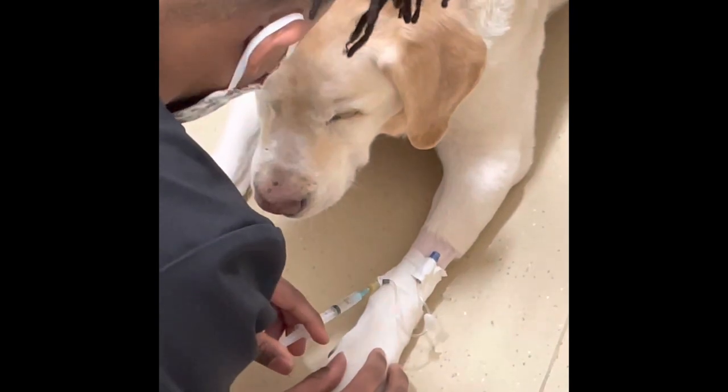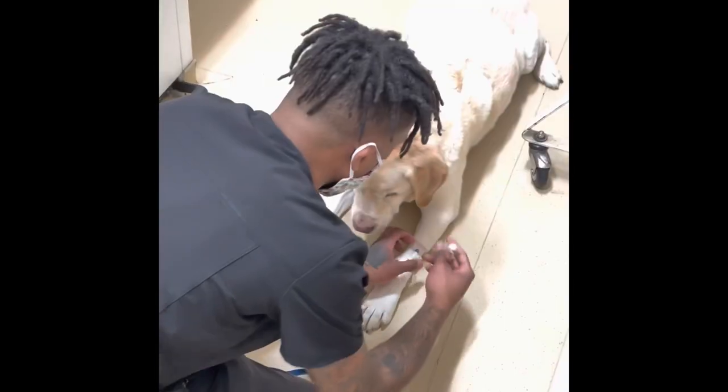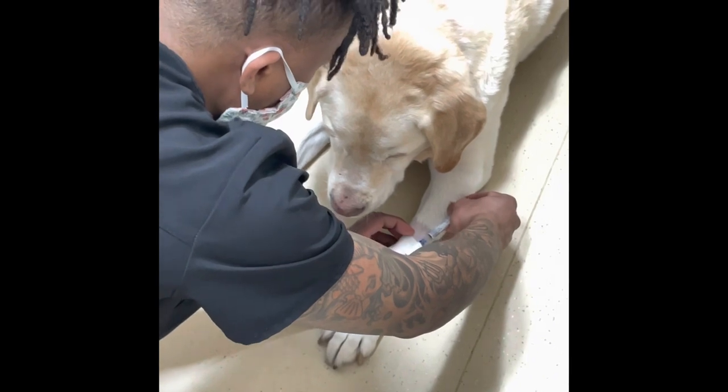First, I'll slowly inject the drugs into the IV catheter. Then flush the IV catheter with saline to make sure all of the drugs flow into the dog's vein. We do this so they work instantly.